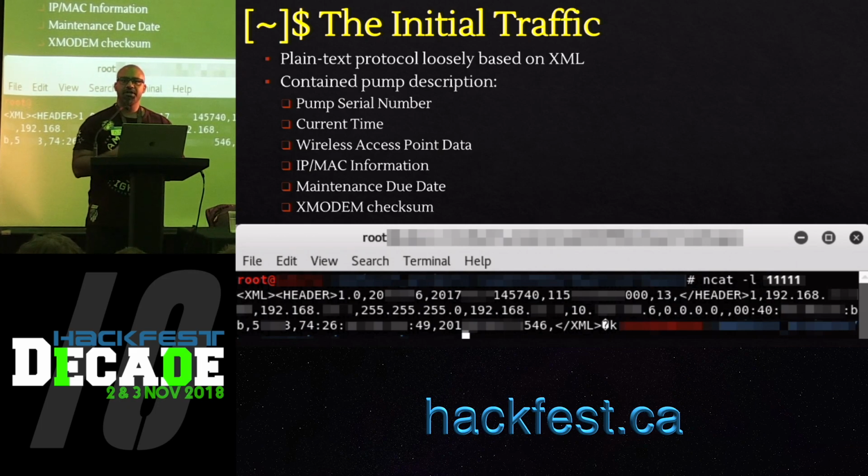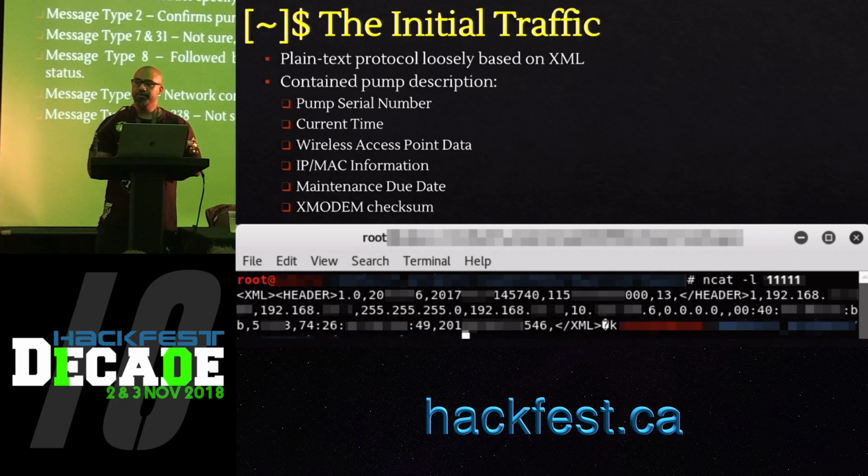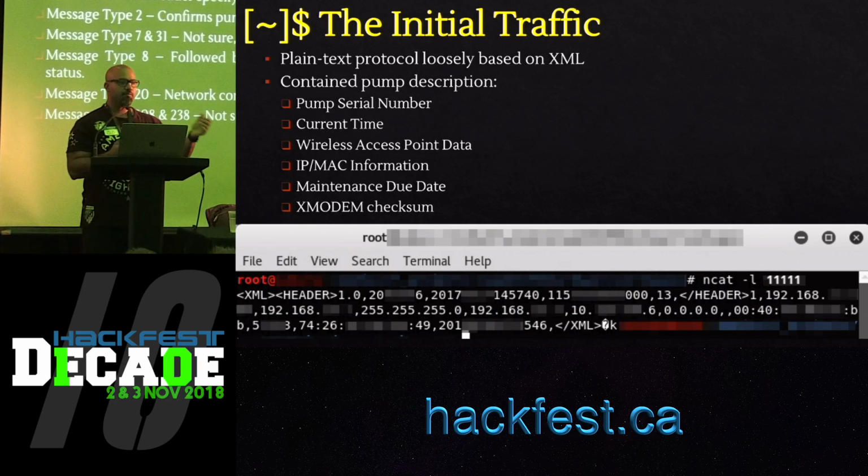Initially, we started doing it manually, but we figured that it might be a good idea at this point in time to start fuzzing this thing with different kinds of packets. So we wrote a Python library, which would receive messages from the Infusion Pump, create different kinds of responses, and then send them back to the Infusion Pump. After doing this for a while, we started deciphering some of the message types.